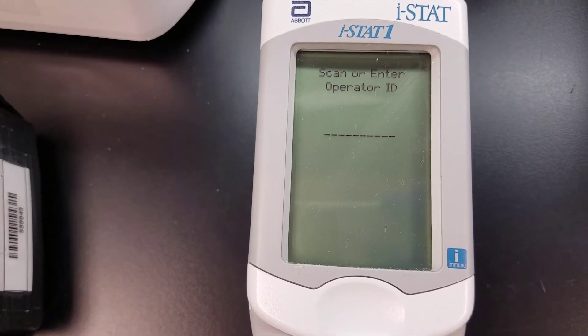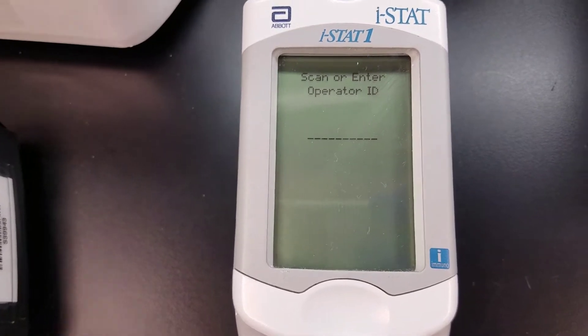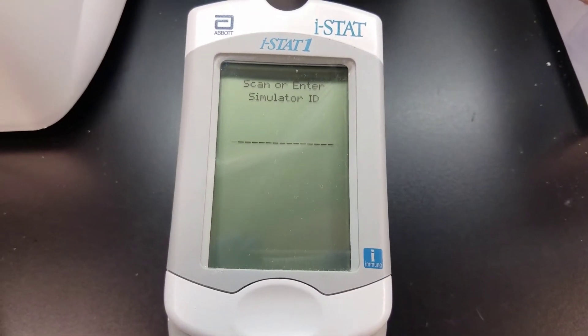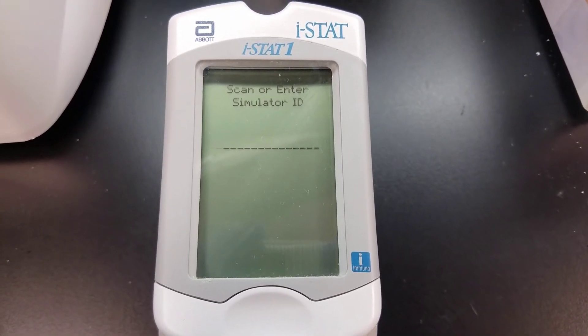This is when you would enter your operator ID — or sometimes there are barcodes you may have on your badge, which makes things a little easier. I'm going to scan my badge now. Once you enter or scan your badge, it's going to ask you to scan or enter the simulator ID.